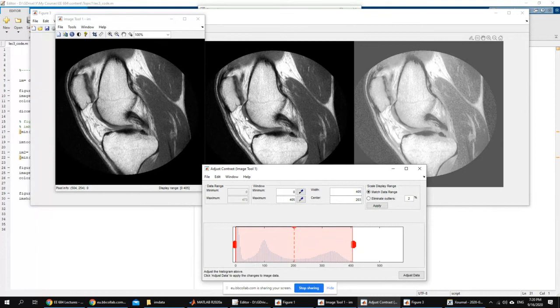When you see an image that looks like this, you see everything in more detail, or basically the contrast between the different grayscale levels is much better than compressing and having a slightly dimmer version of it, like in the one here. Okay, so this is actually very good. So image adjust does a very good job. For this one here, we're not sure really what happened. Let us look at the histogram and compare the two histograms.